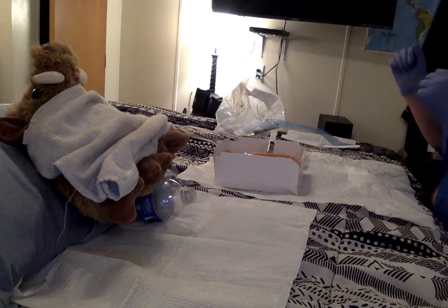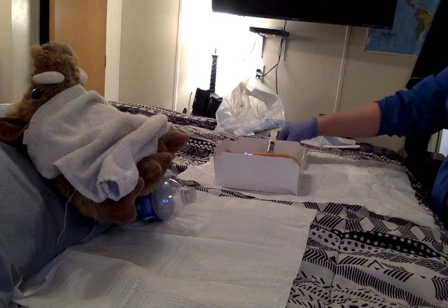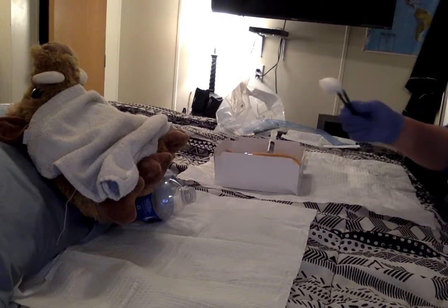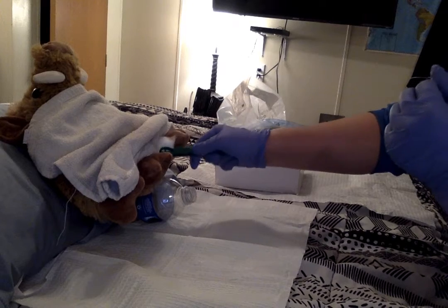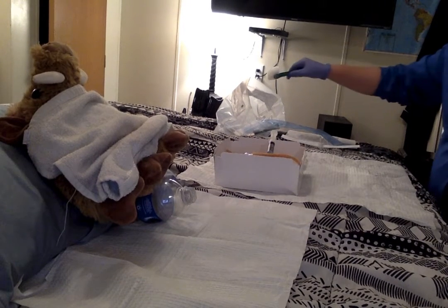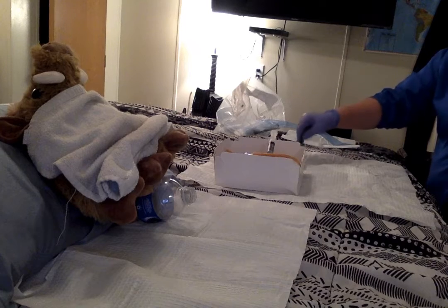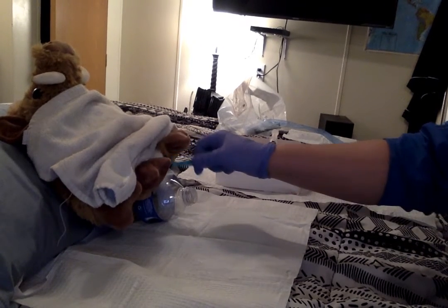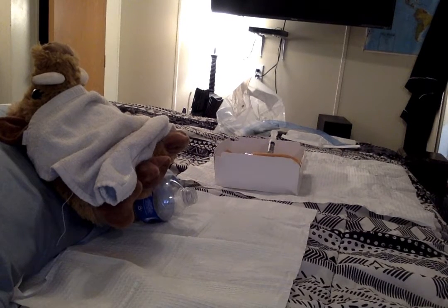And now we can begin cleaning the patient. We are going to grab a cotton ball. We are going to clean the side closest to us, and we are going to throw this in the trash. Next thing we're going to do is we're going to grab another cotton ball. We're going to clean the side furthest away from us, and then we're going to throw this cotton ball in the trash.